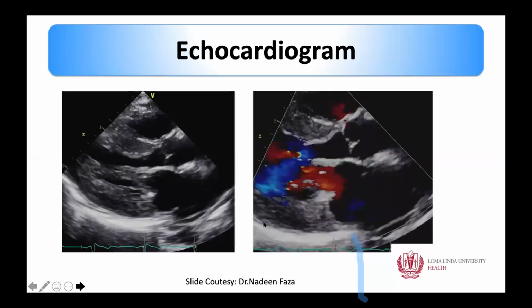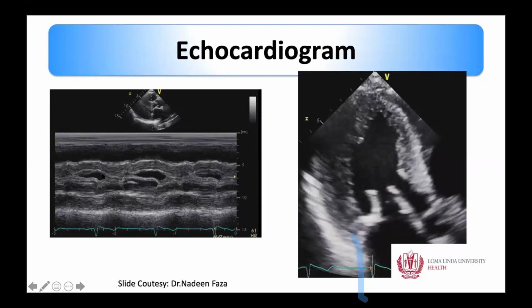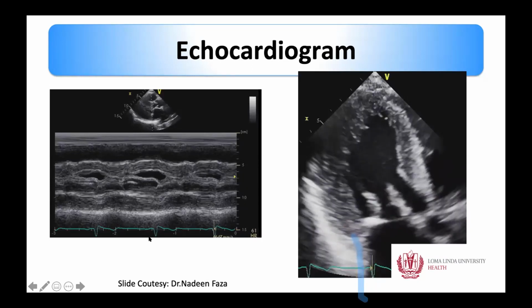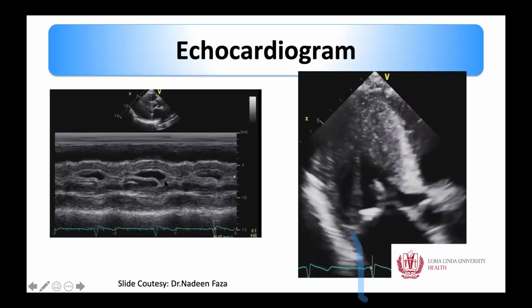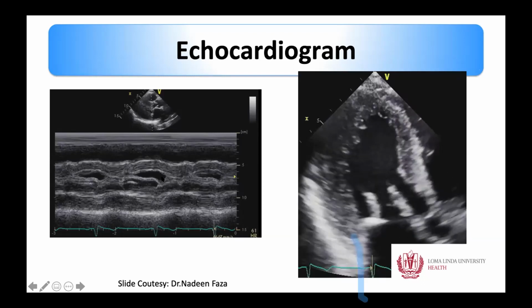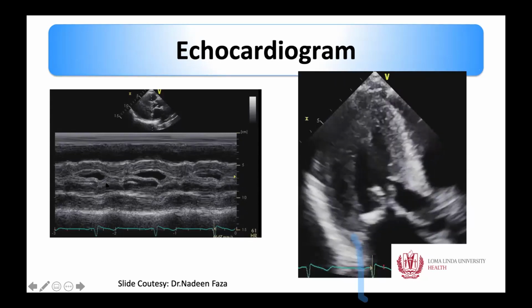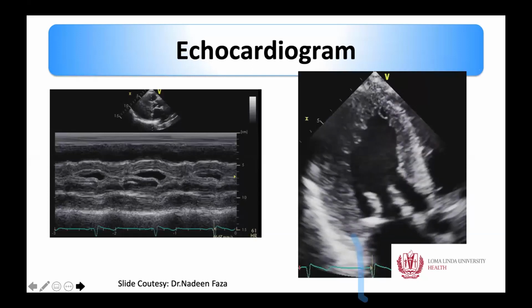And this, of course, is tested on the boards, particularly with the M mode. You can see here this is the systolic period, and you always correlate it with the QRS complex. During systole, there is systolic anterior motion right here of the mitral valve. So keep this in mind. This M mode has been tested for years on the boards, and that's something that you should keep in mind.